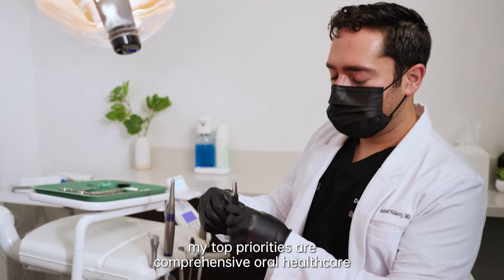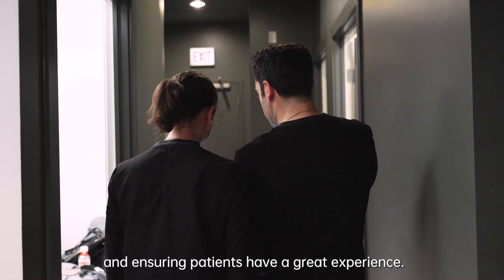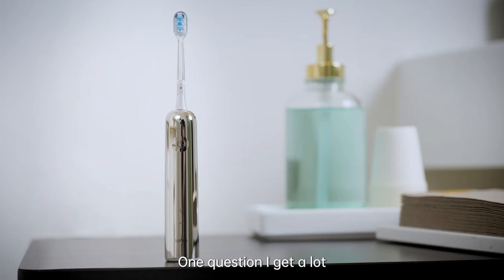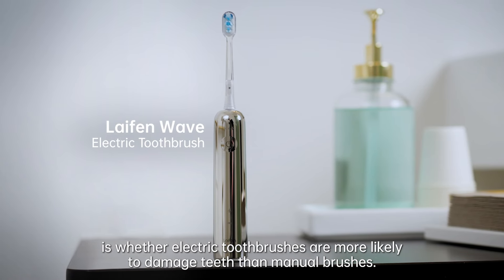As a dentist with my own practice, my top priorities are comprehensive oral health care and ensuring patients have a great experience. Educating my patients on proper dental care is crucial since most oral health care happens at home. One question I get a lot is whether electric toothbrushes are more likely to damage teeth than manual brushes.